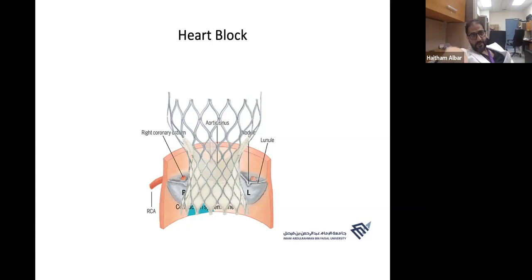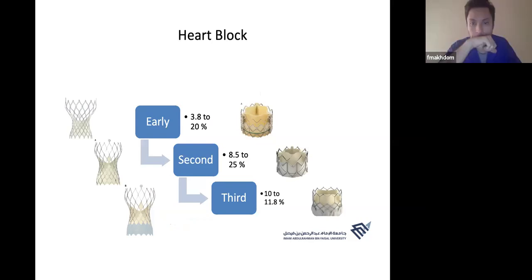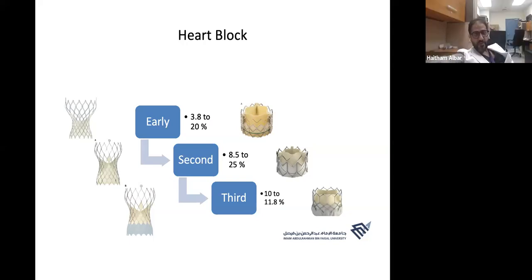Hussein and I read about this specific topic. So the one is radial force. This is the key answer, as Dr. Fahd answered. And the other thing is the risk factors. Meaning, why some of them will develop it: if they have preoperatively any kind of left or right bundle branch block, and you see the picture Dr. Fahd brought, if you have a high calcium burden at the area around the membranous septum, you have a high chance during implantation and at follow-up. And this is what they are showing.